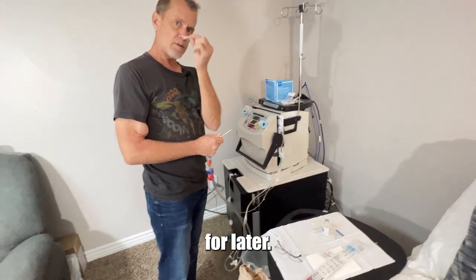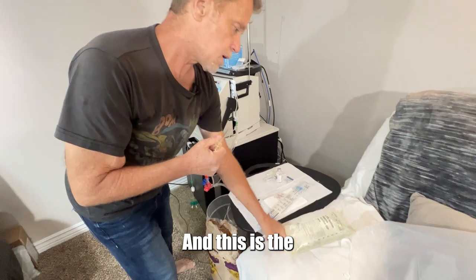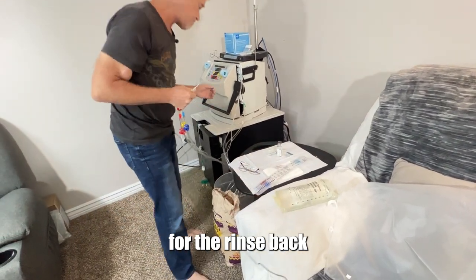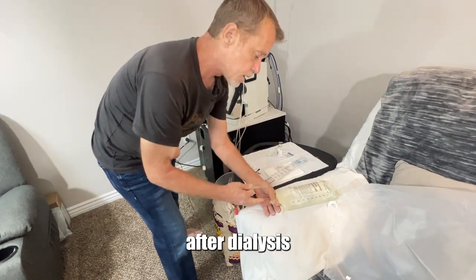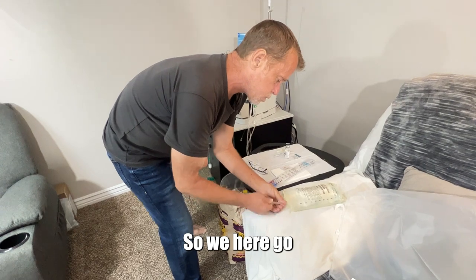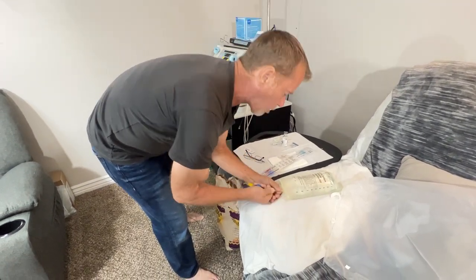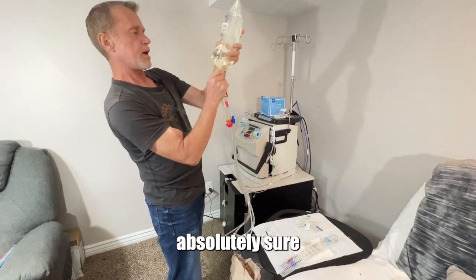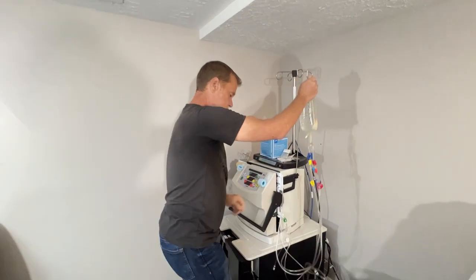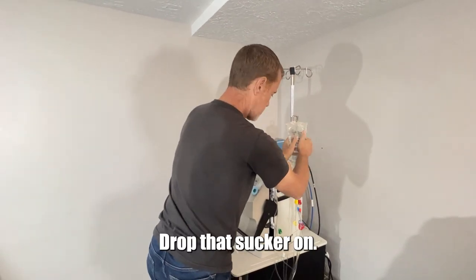You have to save this for later — that's very important. That's the priming spike. And this is the sodium chloride — this is what we use for rinse back after dialysis and to prime the machine. Spike the bag. I give it a little extra push just to make absolutely sure that you have flow there, nothing impeding access. Drop that on.